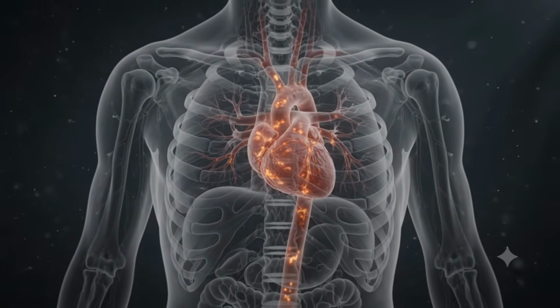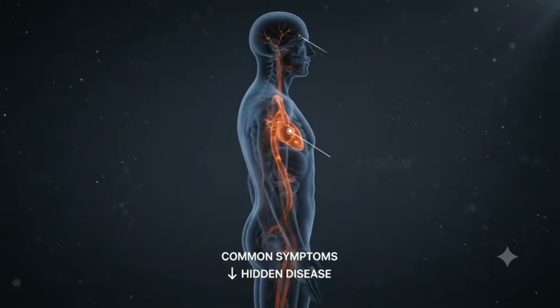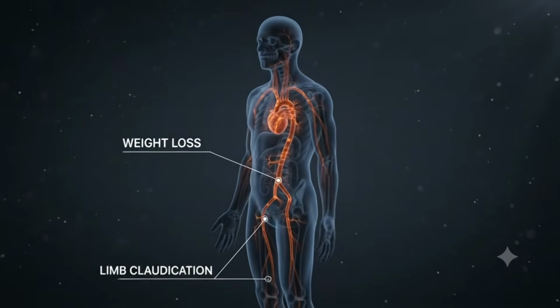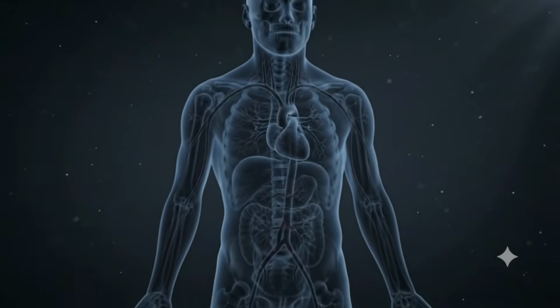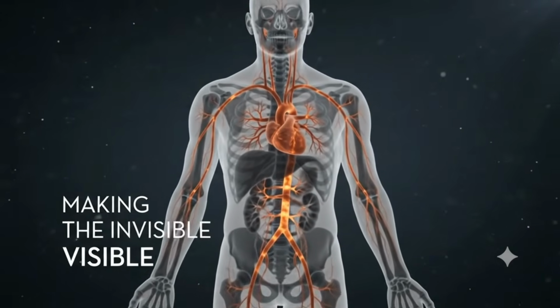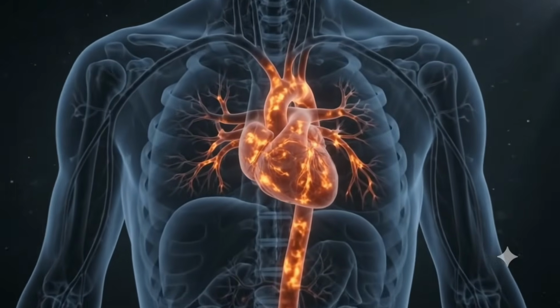irreversible damage becomes visible. Patients rarely present with a single defining symptom. Headache, fatigue, fever, or weight loss may appear unrelated. Yet behind these common complaints, clinical suspicion may raise the question. Molecular imaging can add another layer, showing where inflammation is active throughout the vasculature, beyond what symptoms alone can reveal.